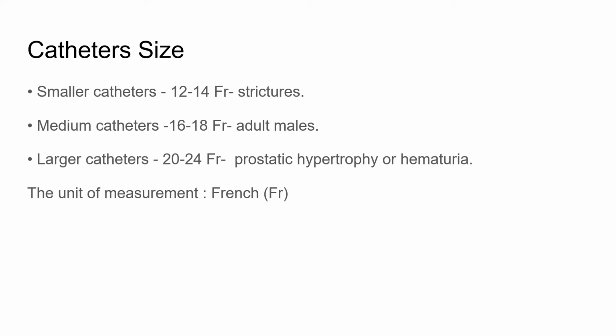So before going to the actual procedure of how catheterization is done, we have to identify the different sizes of the catheters. The size of the catheter is not measured in millimeters or centimeters, it is measured in French. FR stands for French. French is the unit of measurement used in sizing urinary catheters, where one French is equal to 1/3 of a millimeter. So we will tell it in the form of French rather than centimeter or millimeter. So 1 French stands for 1/3 of a millimeter.